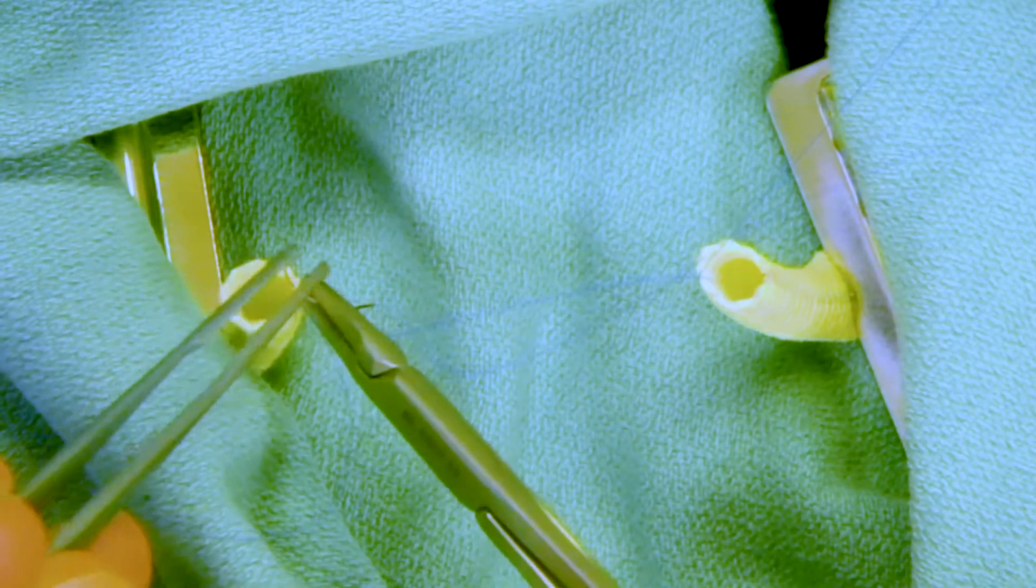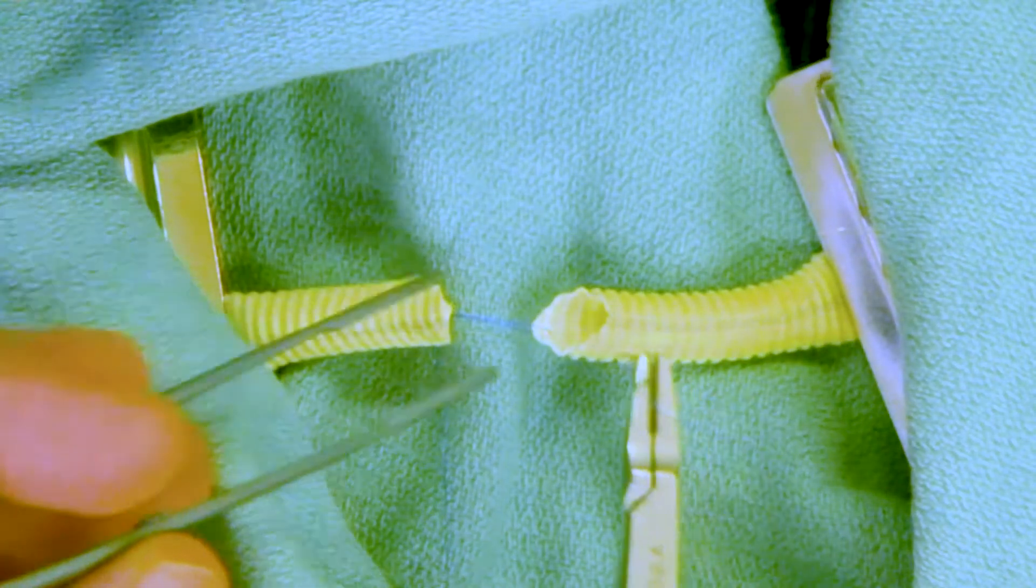We're careful to avoid locking the suture and keep our orientation such that we're on one side of the running suture and not the other or crossing back and forth.